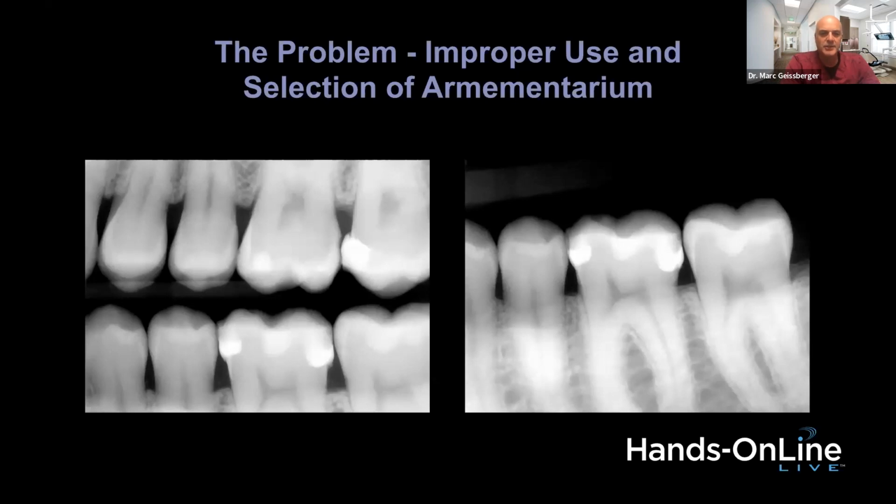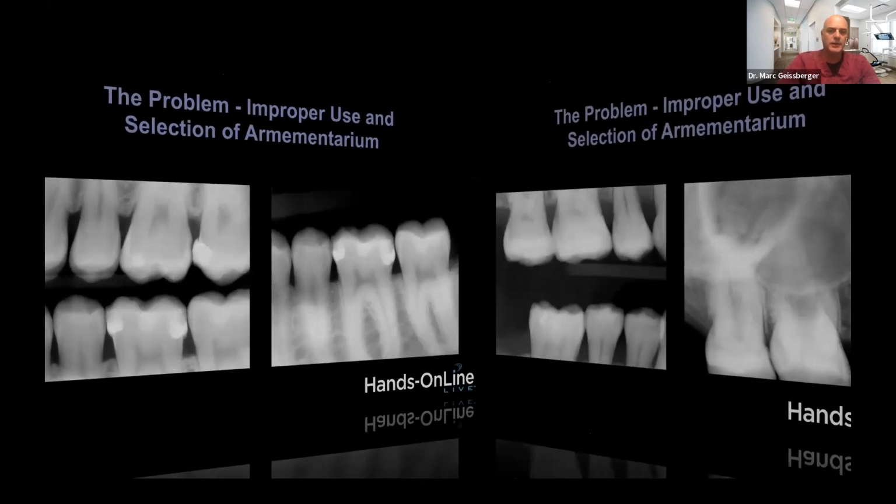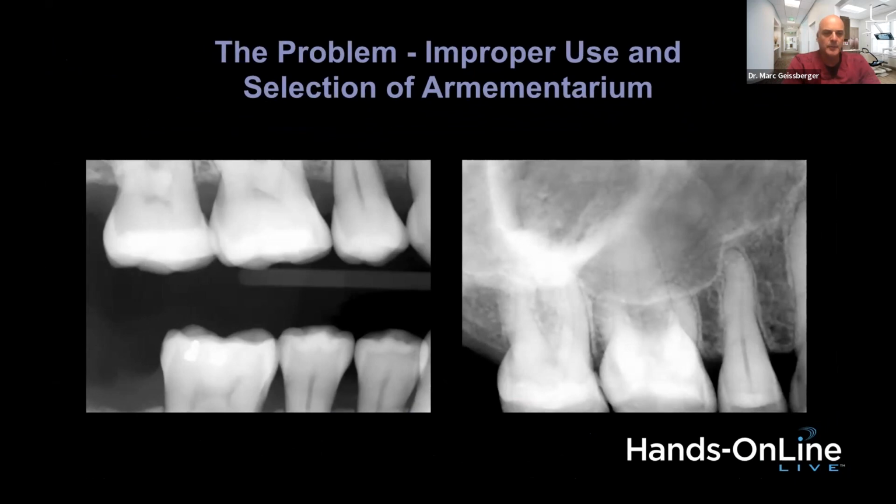Whichever practitioner did these restorations likely did everything wrong, from sectional matrix placement to restoration placement to protection of adjacent teeth. And it saddens me to see this in my practice on a fairly routine basis. I'll show you another clinical case where things appear a little better on this upper second molar from a bite wing standpoint. But if you notice in the PA, you can see an overhang of restorative material and no proximal contact.